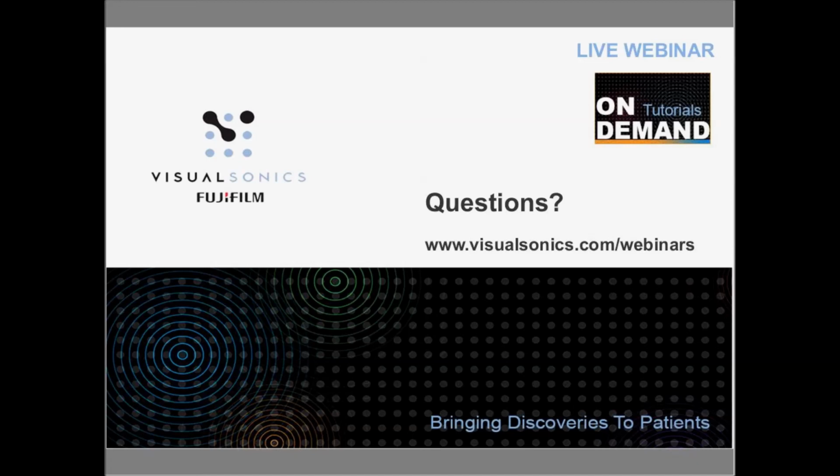Now, higher frame rates on the imaging system are dependent on a number of factors. Transducer selection is really key. The applications and presets for cardio scanning are already set to have a single focal zone, which will bring your frame rates way up. One of the things that you have a lot of control over when you're scanning live is the image width. And by bringing the image width in, you can drive your frame rate up.